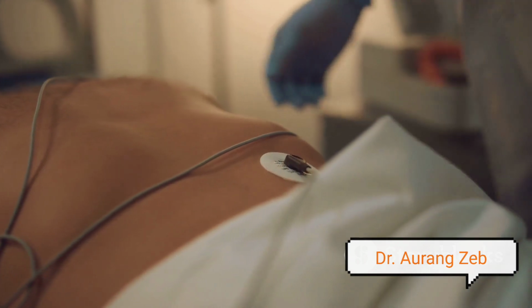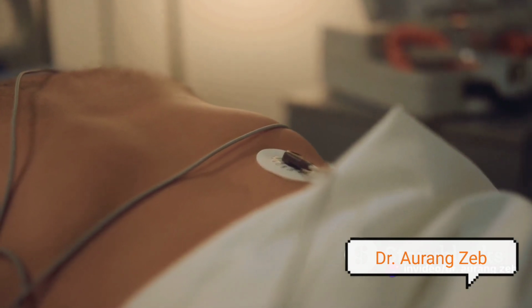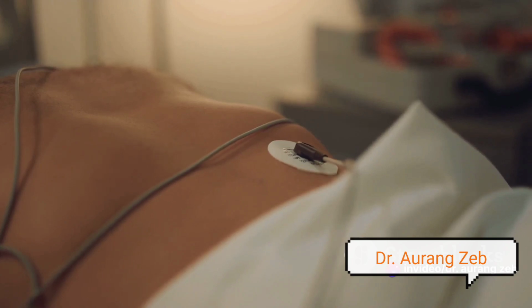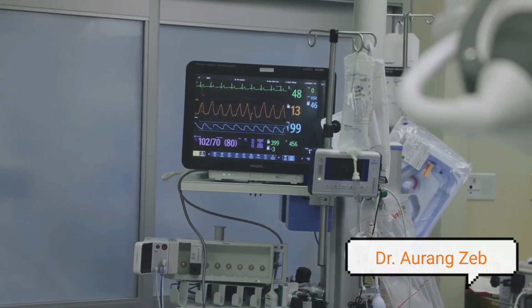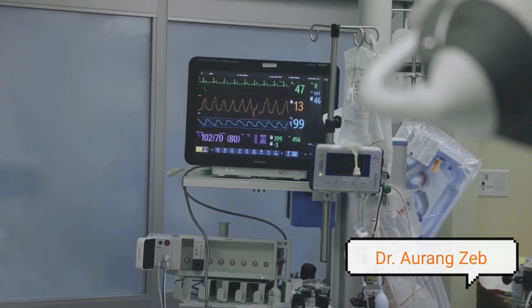Lastly, we looked at interpreting the images and creating the report, translating the technical information into a format that can guide patient care. This was just a primer, a stepping stone into the vast field of echocardiography.